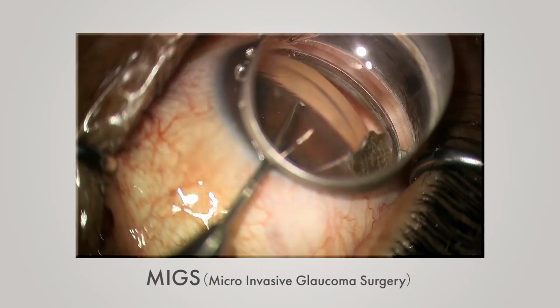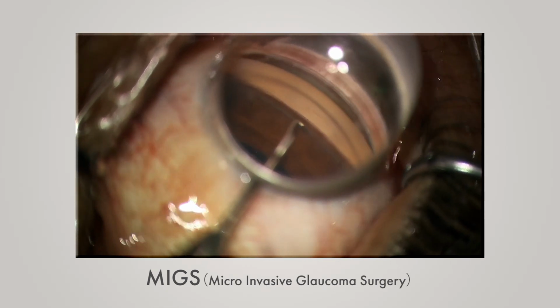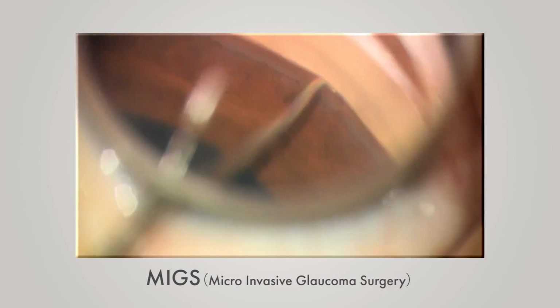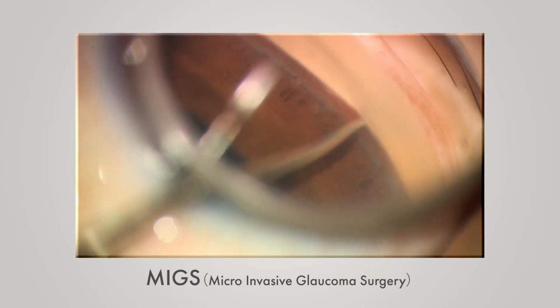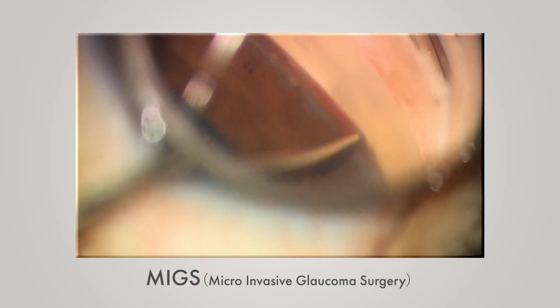Microinvasive glaucoma surgery is a recent surgical technique for reducing the IOP for glaucoma patients with mild to moderate symptoms, due to its much lower burden on the eye and shorter operating times with far fewer complications. This technique is widely praised.